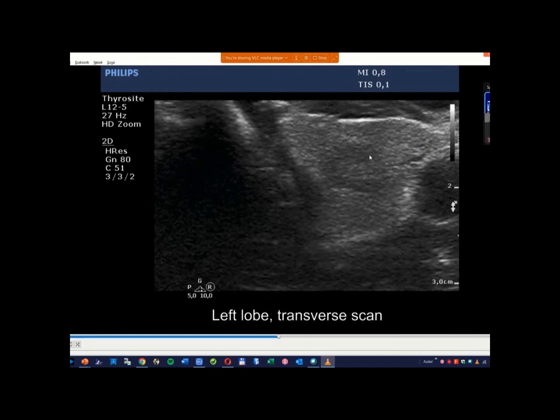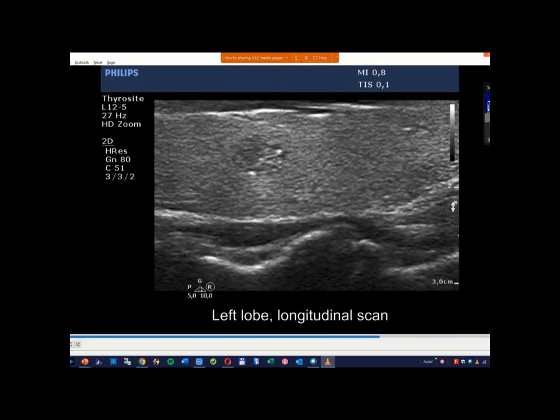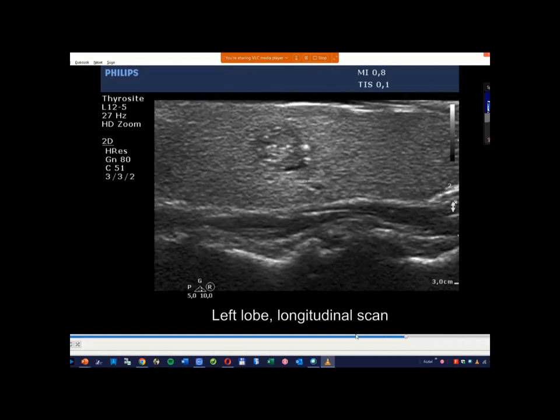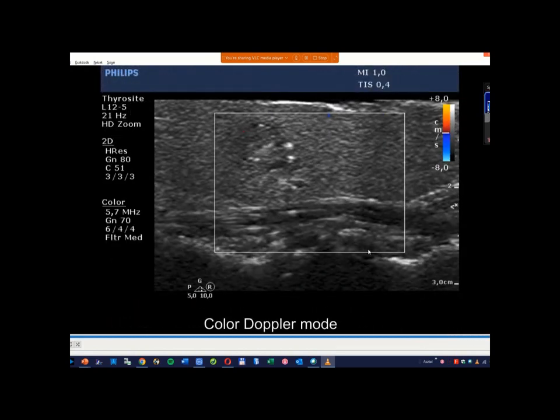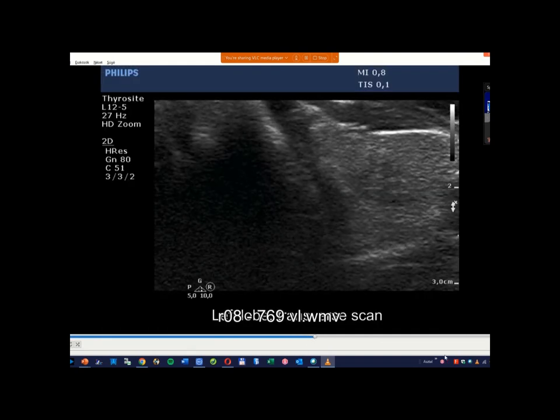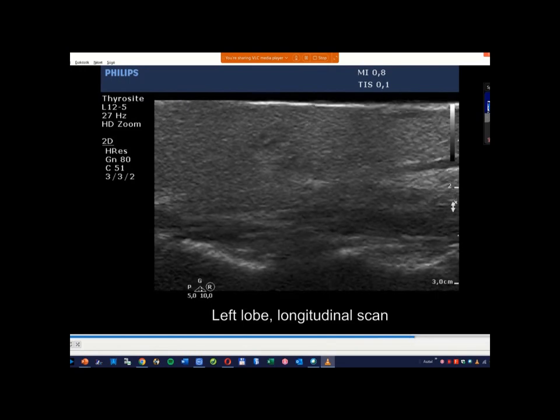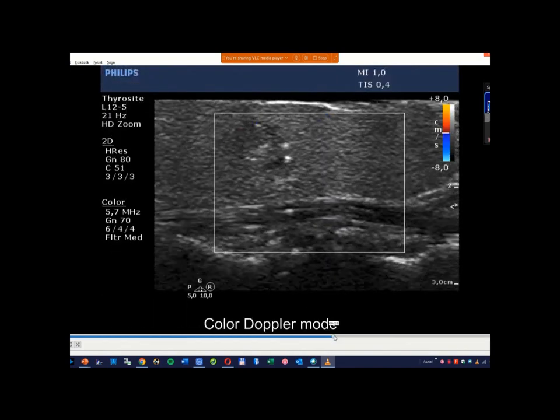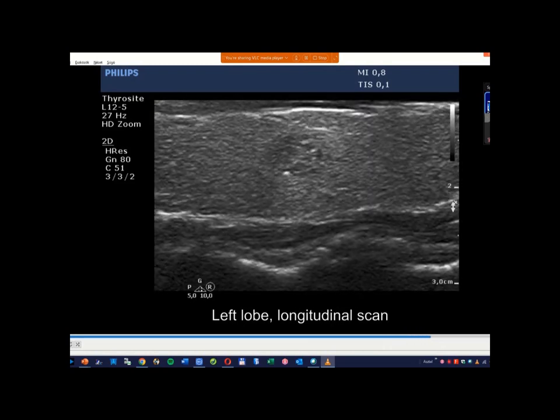So, how to judge this discrete lesion? What is your opinion regarding this lesion? What kind of echogenic figures does it have? No one wishes to comment on this case? It is suspicious for me. Yeah, agree with you. Although it has comet-tail figures clearly, these echogenic granules are really disturbing. I don't think that we can clearly state that these are microcalcifications, but we cannot exclude this possibility.